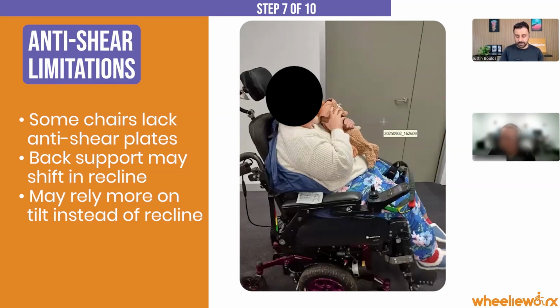But for me, that's the challenge you're going to find with bariatric seating: you want back canes so you can get the bottom underneath. But when you go back canes, your power recline usually isn't effective enough to maintain a position on their back when they go into recline. Yeah, because she's quite a small height. Petite person. Yes, she's quite petite. She's wide.